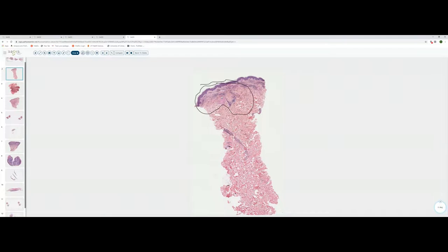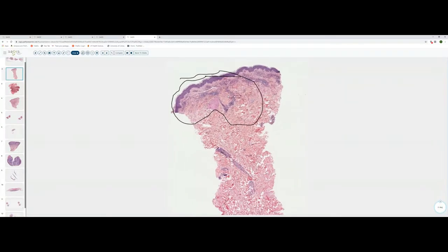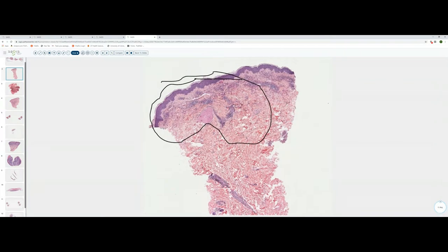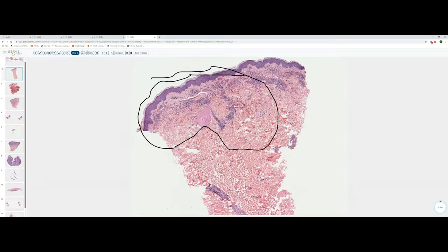And one can see within the dermis a superficial perivascular and interstitial infiltrate that contains lymphocytes and numerous extravasated erythrocytes. And any time you see a lot of extravasated erythrocytes within the dermis, you want to make sure you hone in on the vascular integrity to make sure that that is intact. If we move to higher power, we can see that the infiltrate is not only perivascular, it's a little bit interstitial. And when you do see an interstitial component to a perivascular dermatitis, nine times out of ten, the infiltrate is going to be mixed.